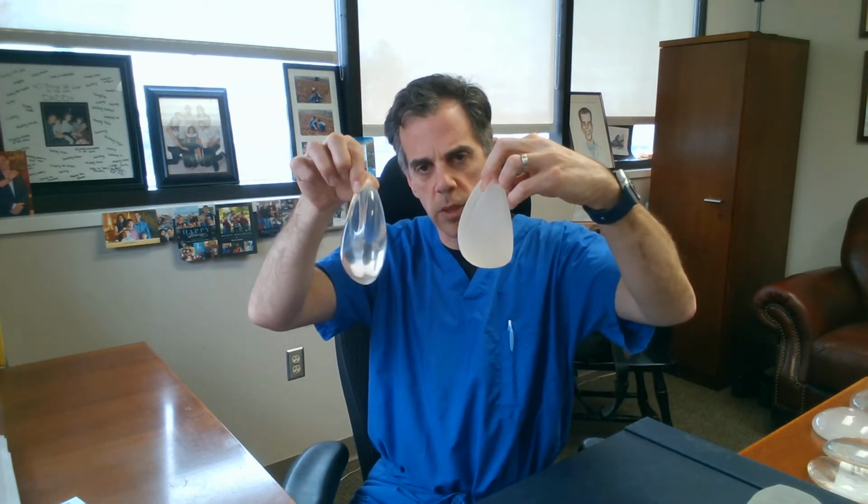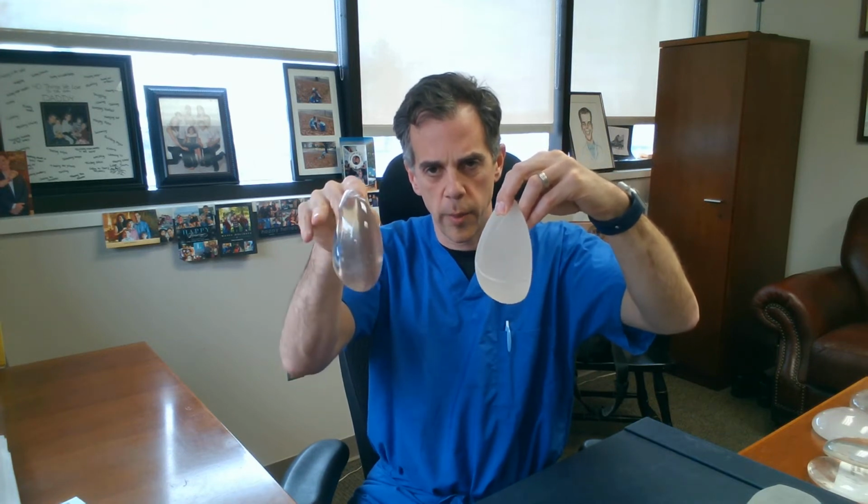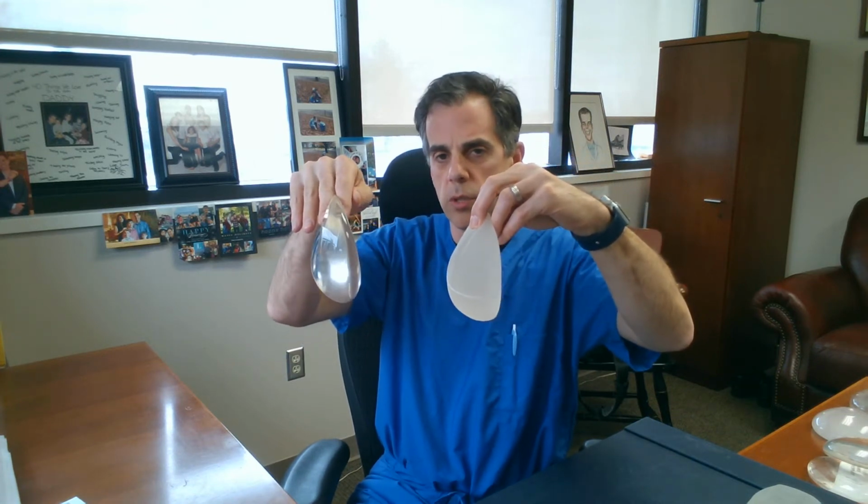People say, well, what's the difference between silicone implants, and you've heard information about textured breast implants and textured shapes, and I have examples of those here. We don't use a lot of textured shaped implants anymore in this practice, sometimes in reconstruction, but for the most part, the shape and the look of an implant that you're going to get in the body when you're standing upright is similar to what the shaped implant will be. The difference is that a shaped implant, if it turns, will look more unnatural versus this implant, which, no matter what angle, is going to keep that same natural shape to the breast.